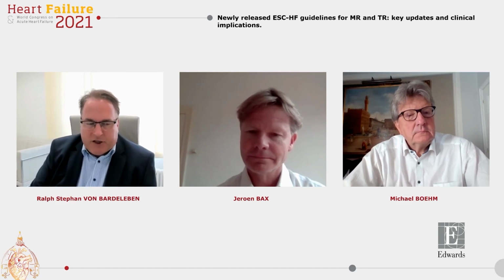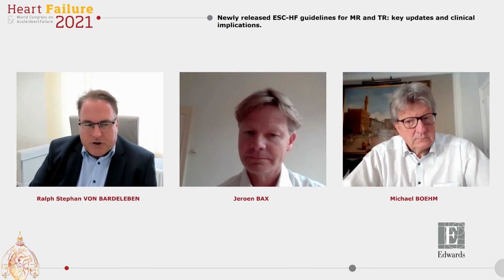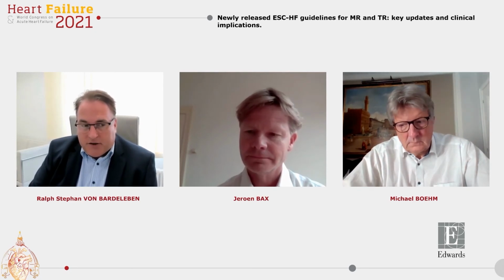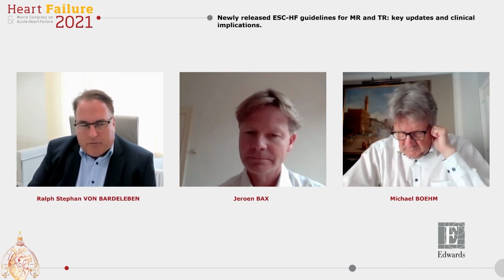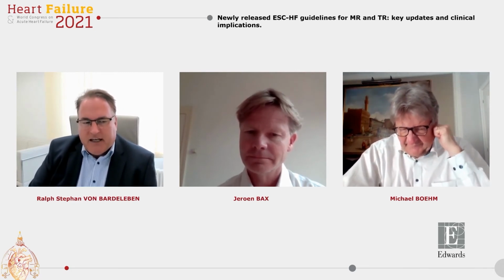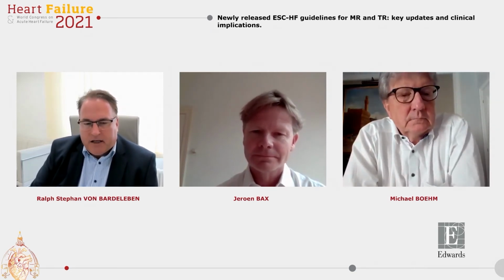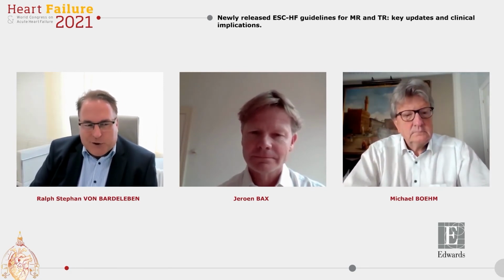And we know that the hazard ratio is between 1.8 to 2.7 for mortality if you have a persistent TR or a severe, massive or torrential TR at baseline. These patients really die with a number double as high than those who are also then treated. And we know from the non-randomized but propensity score match data from Teramasu from the TRIVALVE registry that actually if you treat both, you fare better than for single therapy alone. And I think this is an important message. And the data came from the US and also from your center.